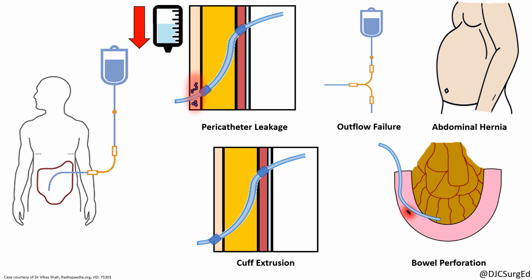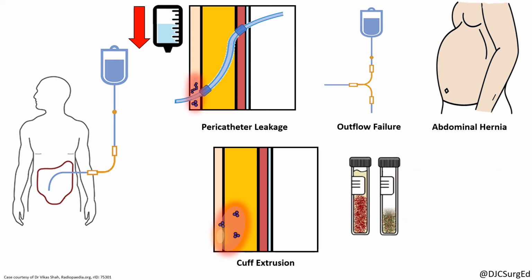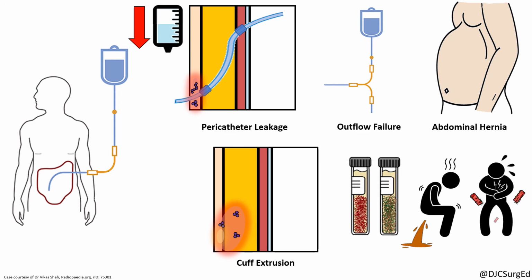Erosion of the catheter cuff to the skin may be a sequela of exit site infection or excessive superficial cuff placement. Cuff shaving or catheter removal may be required in the presence of infection. Intestinal perforation can occur at any time after catheter implantation because of direct injury or weeks to months after placement because of bowel erosion. Signs of perforation are feculent or bloody dialysate, dialysate retention, diarrhea occurring after dialysate instillation, or gram-negative peritonitis.